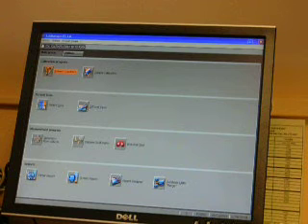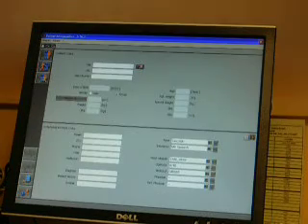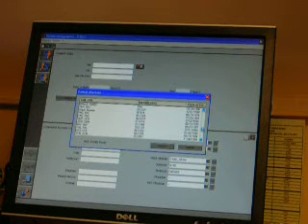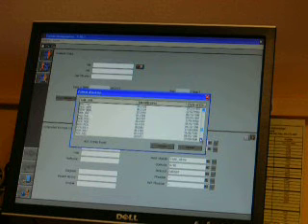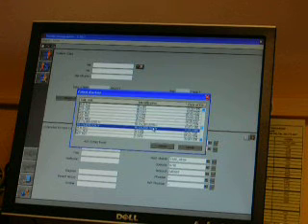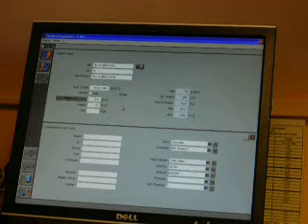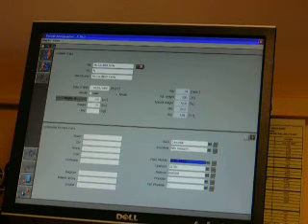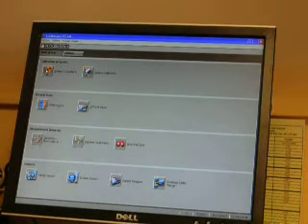You want to select the calibration patient. Every system has its own calibration patient. This particular system is N. You want to accept it. It's a standard height and weight, and that had been changed. So you enter the calibration patient, then you go into the ambient conditions.